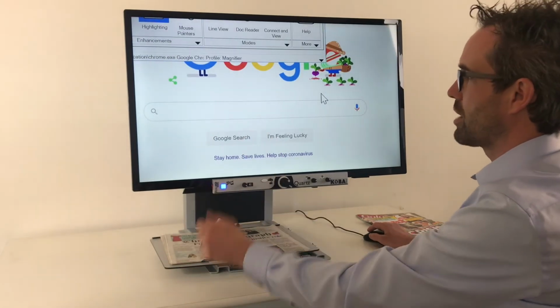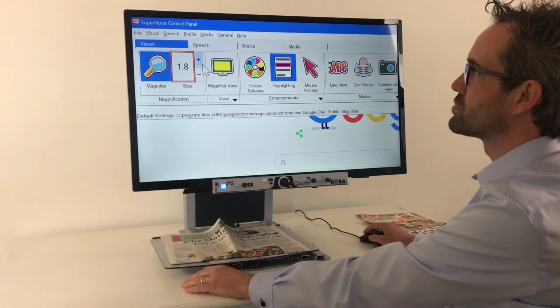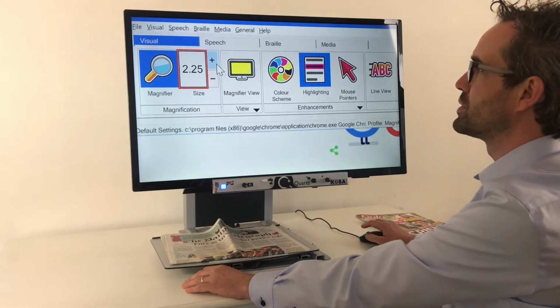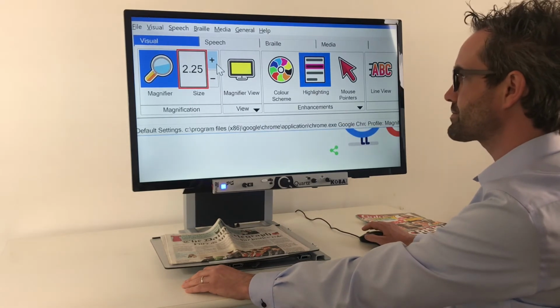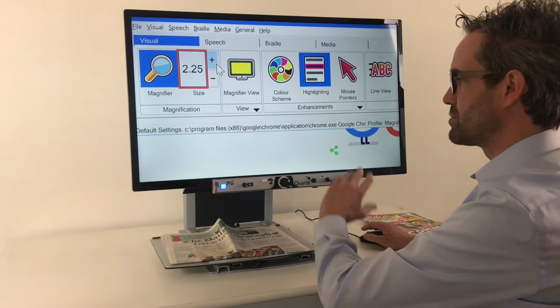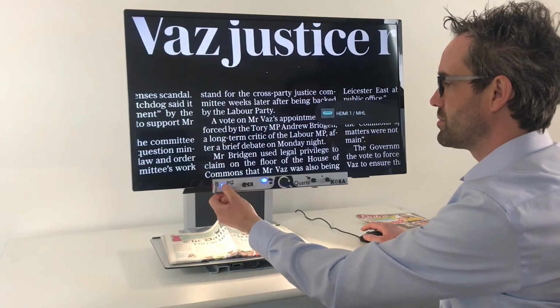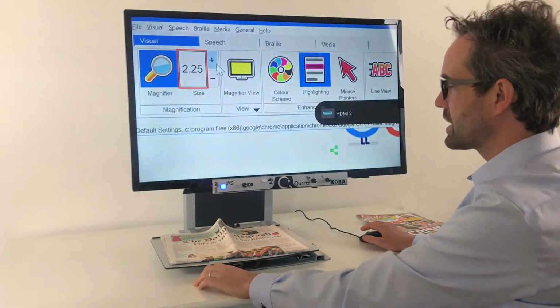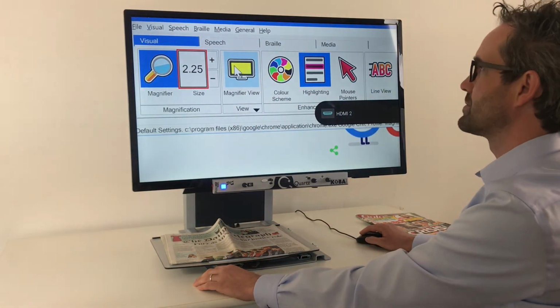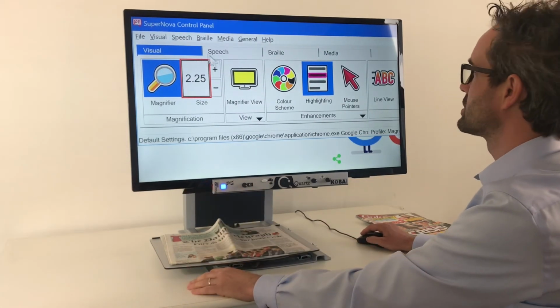You'll notice that here I'm on Google, and we are using a magnification software, Supernova, but it's also possible with ZoomText. The first thing you will notice is that you can switch between magnifier and computer with this button. But you also have a second possibility, and that's split screen. We are using the function in Supernova as well as in ZoomText.